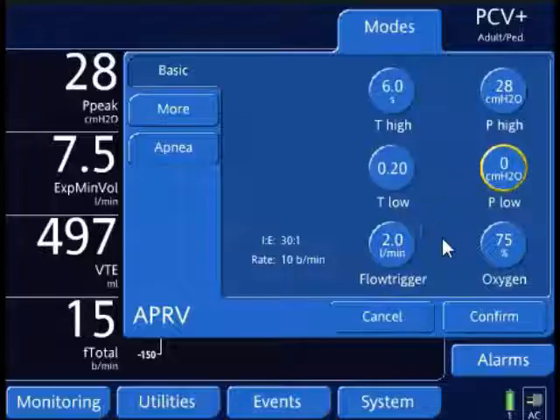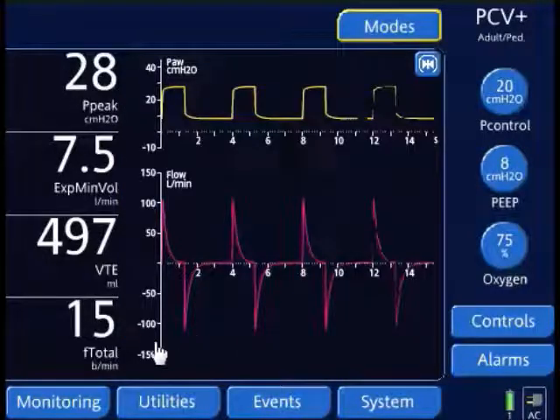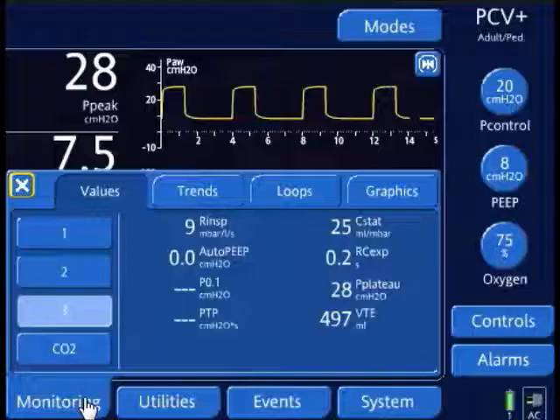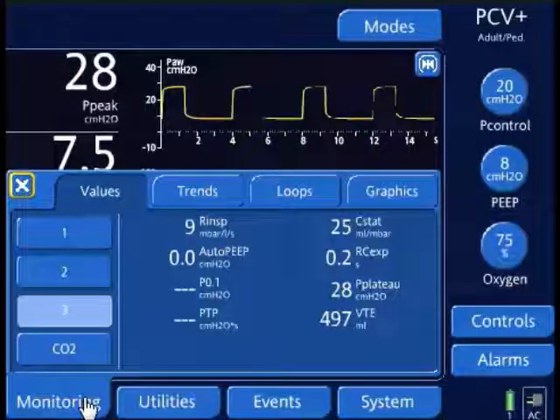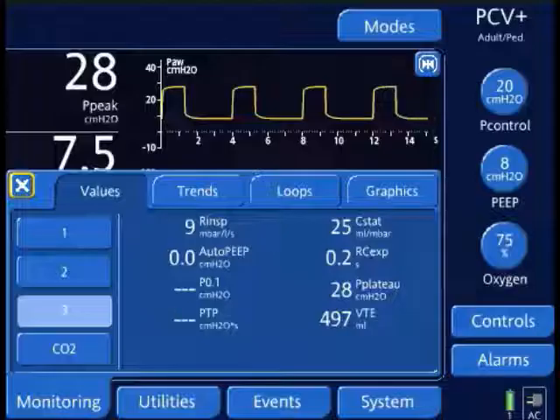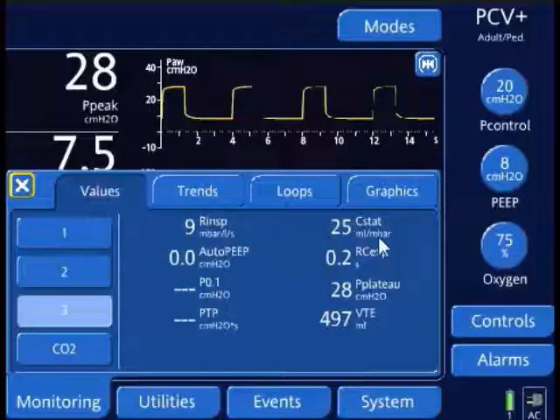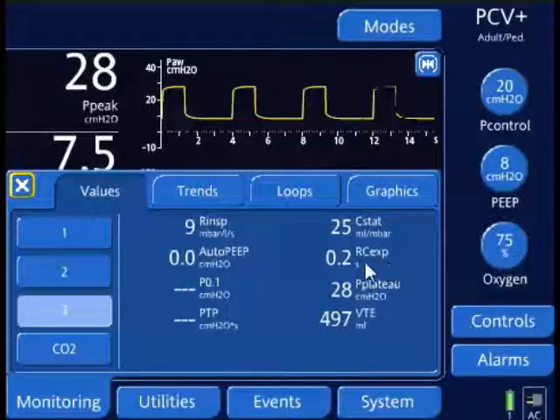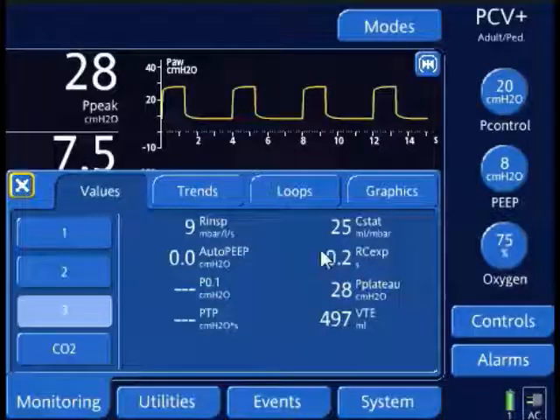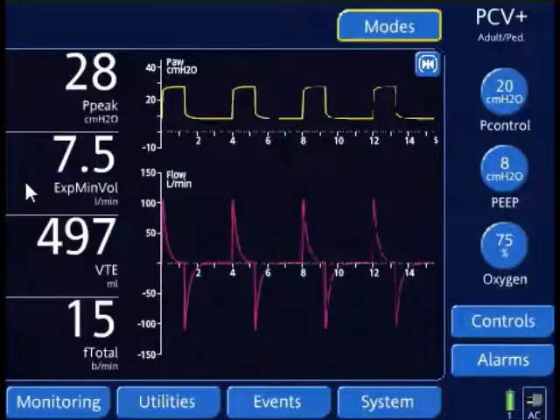That's one thing I need to look at, so I'm going to cancel this for now and go to monitoring. Some ventilators will calculate an expiratory time constant for you — Hamilton ventilators calculate one, and the ServoEye also calculates an expiratory time constant. You can also mathematically calculate it using the time constant equation. Under my monitored values, right under compliance, I see RC expiratory — that is resistance times compliance, expiratory — which is my respiratory time constant of 0.2 seconds. I'm going to use that to set my T-Low.